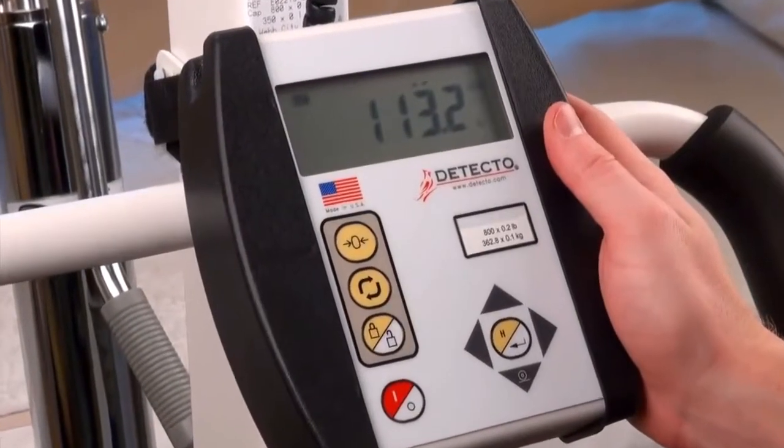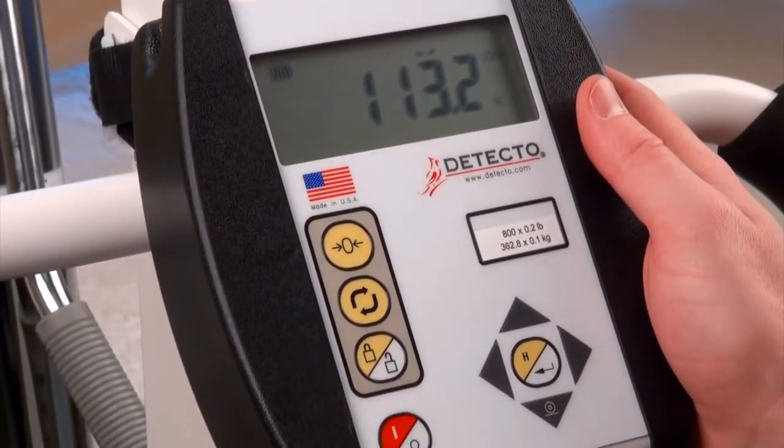Once the weight is stable, the weight will be automatically locked in on the indicator and remain that way until the lock release key is pressed.